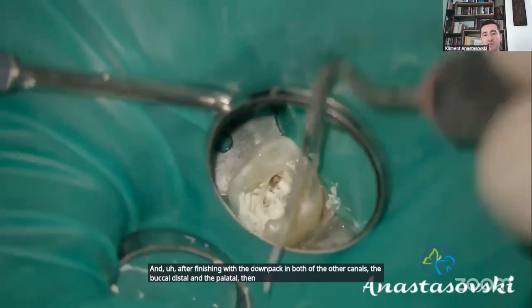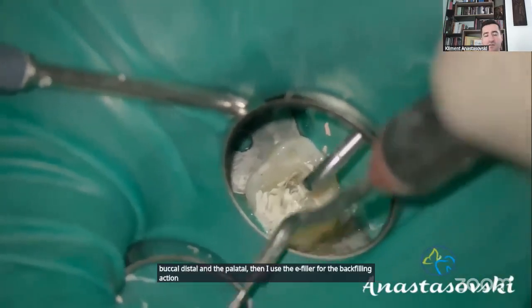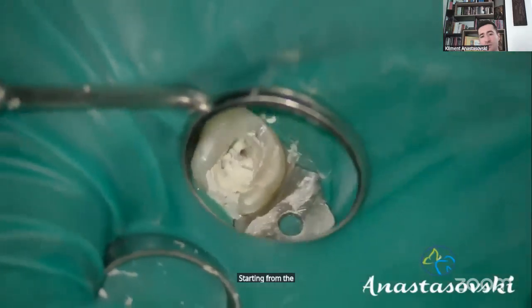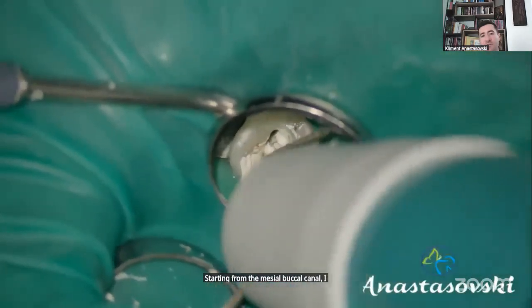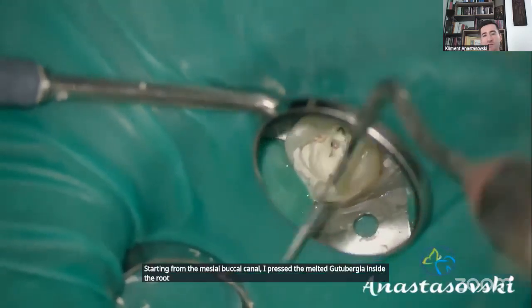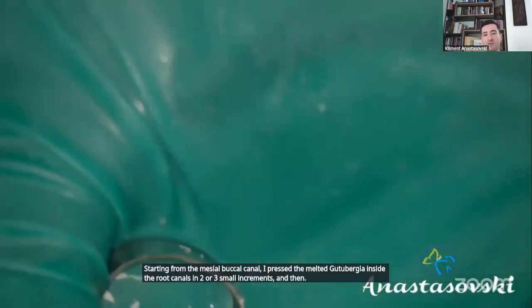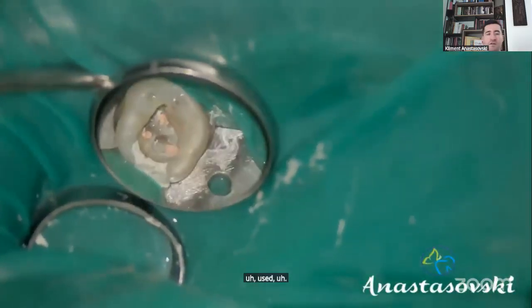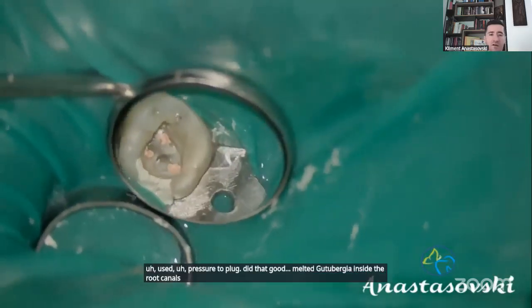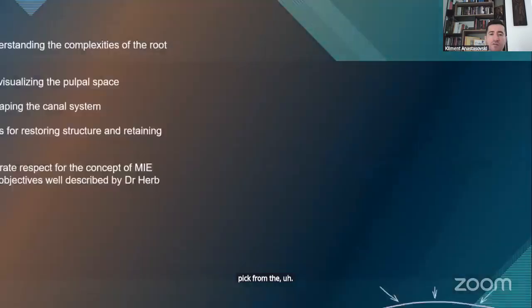I use the E-filler for the backfilling action in this obturation step. Starting from the mesiobuccal canal, I pressed melted gutta-percha inside the root canals in 2 or 3 small increments, and then used pressure to plug that melted gutta-percha inside the root canals. And this is the final picture of the obturated root canals.